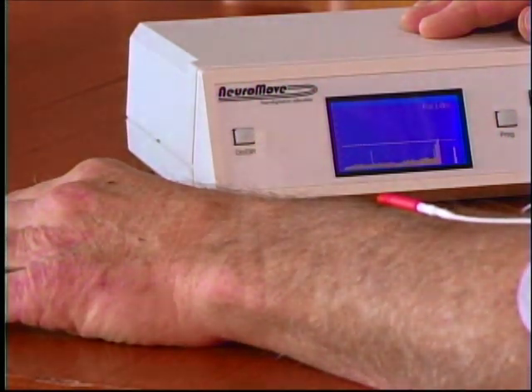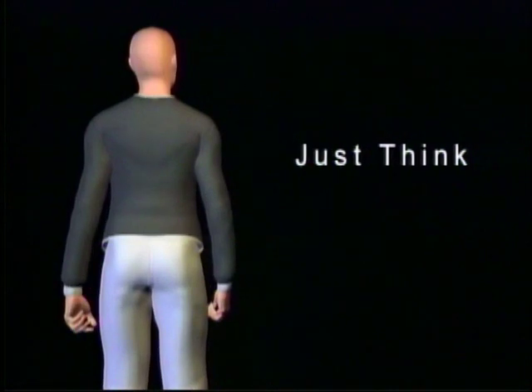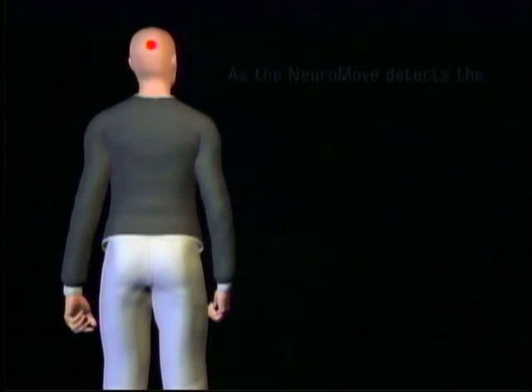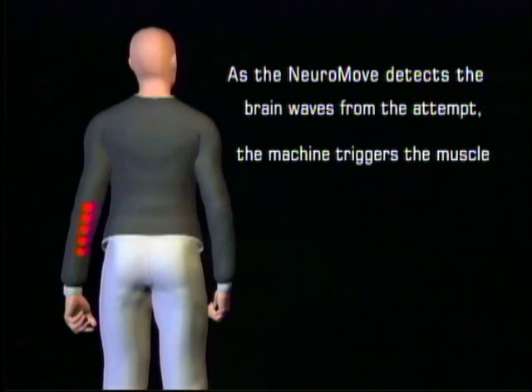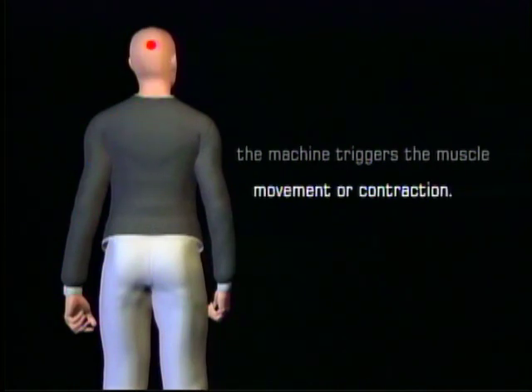Relax. Just think. Concentrate. As the NeuroMove detects the brain waves from that attempt, the machine triggers the muscle movement or contraction. That triggering gives you both visual and sensory feedback — in other words, you will see the muscle movement and you will feel a warm vibration. These show that you're thinking on the right path.